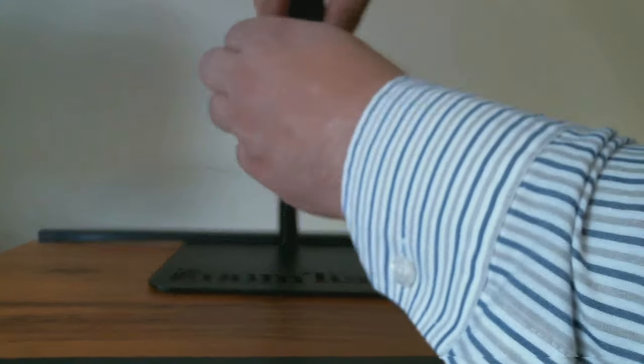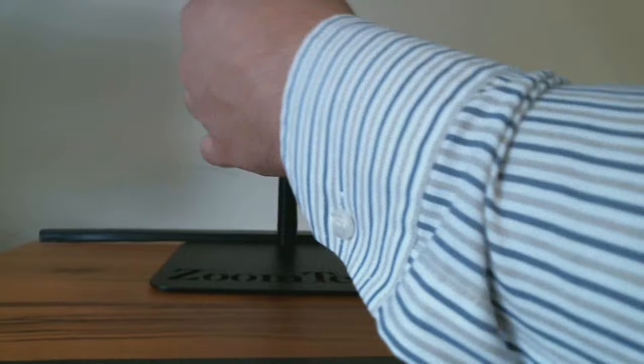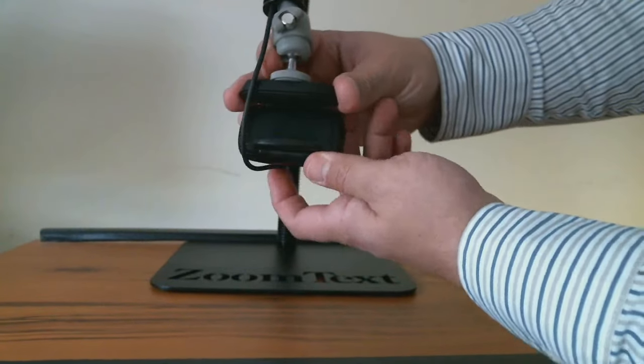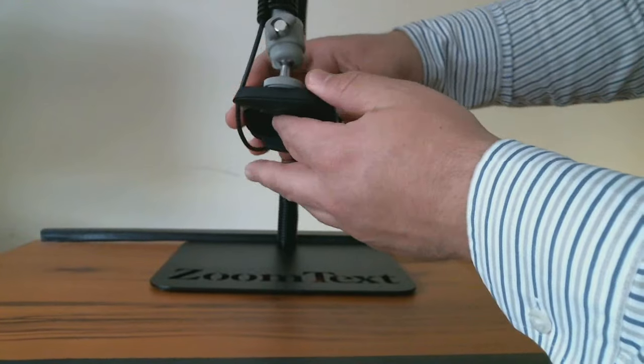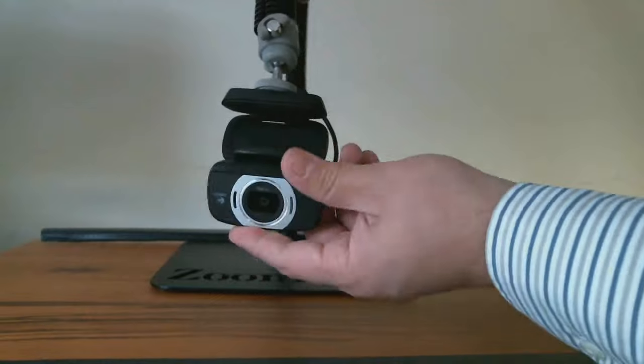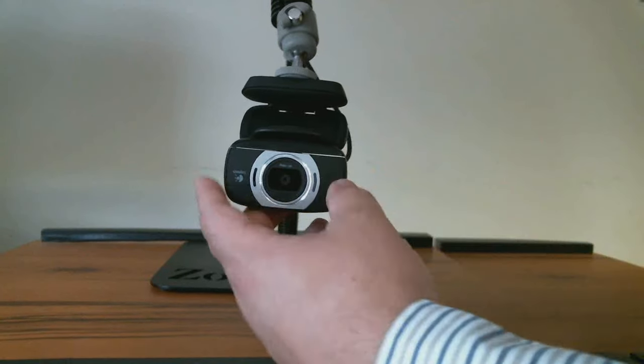So what you're going to want to do is pull the wire a little bit just to get a little bit more extra length here. And you're going to pull this down and out, and you're going to see that the camera is actually, let me see if I can show this to you. So you can see the eye of the camera right there.